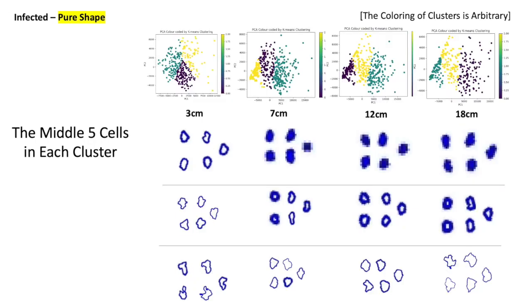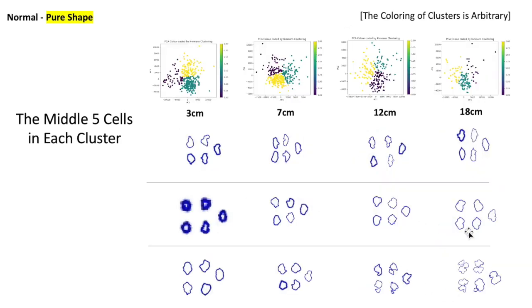And interestingly, when we measure the pure shape of infected lungs, we see again that there is a collapse due to pressure, right, in this smallest category. Now these are circles, these objects are filled in. They do have a white space in the middle, but they're so small that our software algorithm accidentally filled them in. But as you can see, even when measuring shape apart from size, there are three distinct groups, and pneumonia infection prevents the two larger categories from reaching their full level of complexity when compared to pure shape in the uninfected lung.